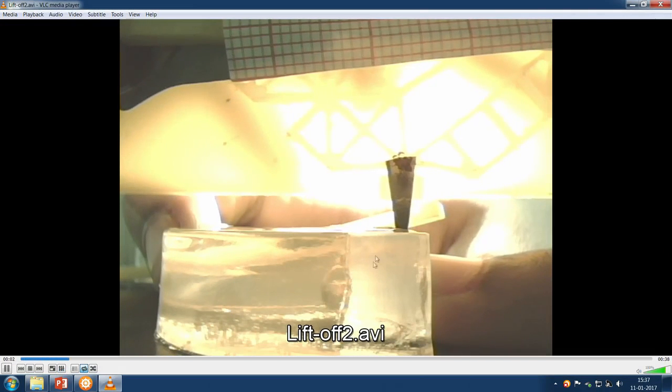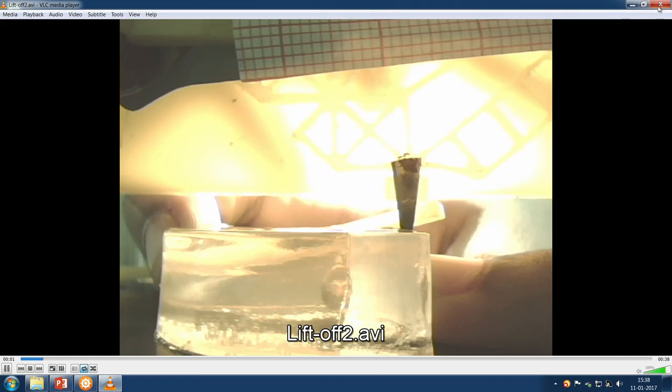This is the stiff PDMS, and it rides over it. When it comes to the hydrogel portion, it will just cut it. So, now the scalpel is up there, not actually cutting, just riding over it, and when it comes to the flexible part, it will just dip in. Yes, so it went in and started cutting along this profile. The stiff or strong one is not cut, and the flexible one is happily cut. So, this compliant mechanism, the retraction feature, is used in this particular device.